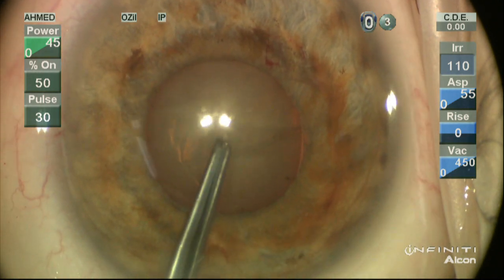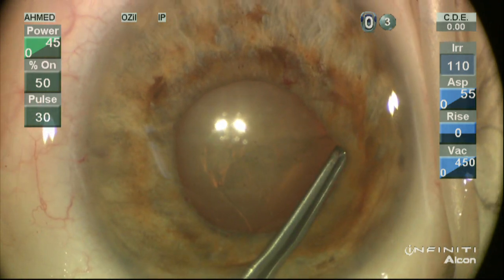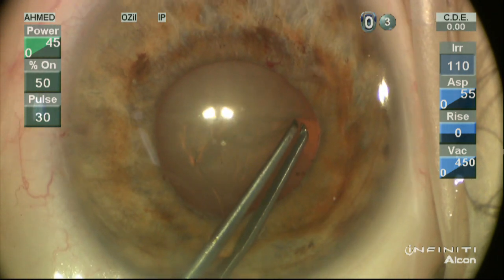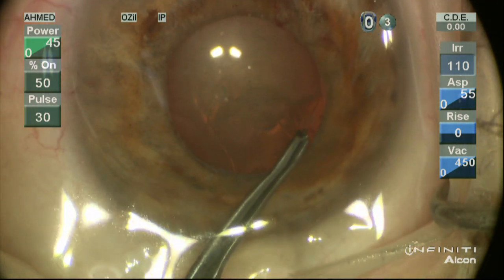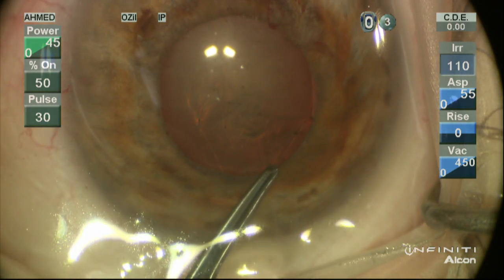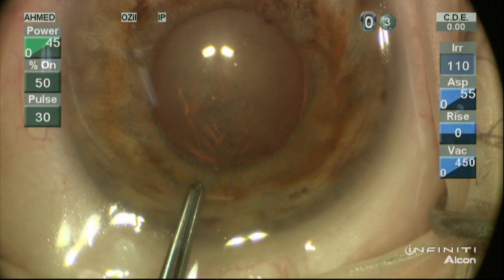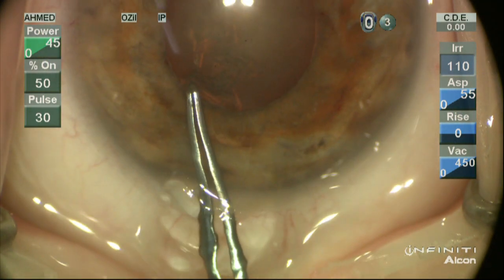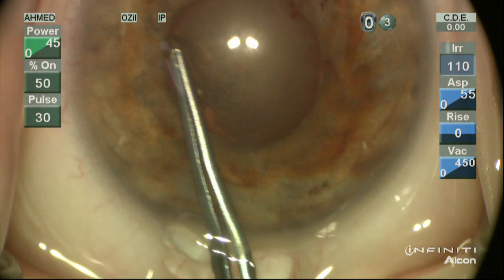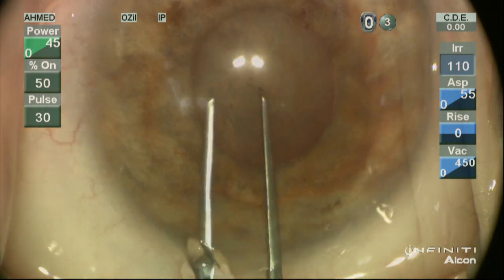The benefit of the Helon 5 really helps us know that the likelihood of the rhexis running out is low. We can see the rhexis is running in a good manner. The challenge of small pupil phaco is not so much working through a small pupil but working through a potentially small capsular rhexis. No matter the pupil size, as long as the capsular rhexis is large enough, we can extract nuclear fragments even through a very small pupil.